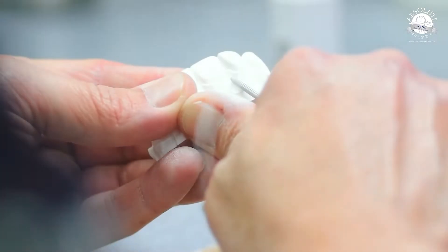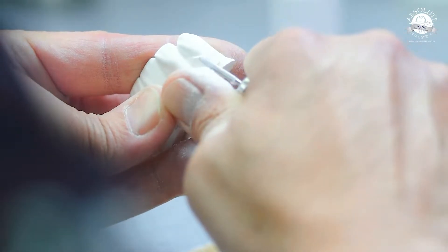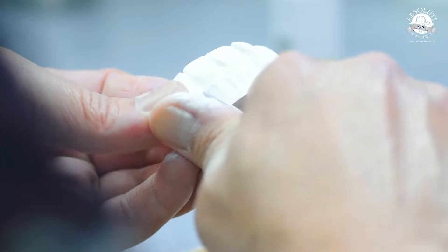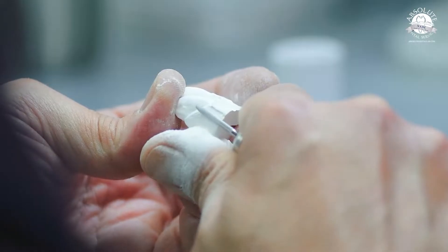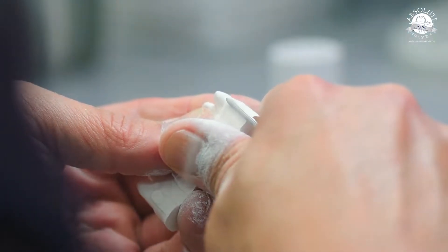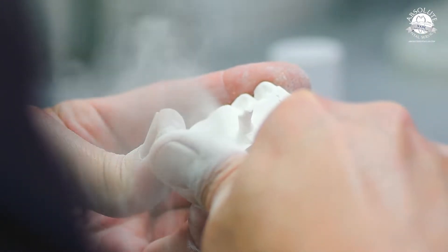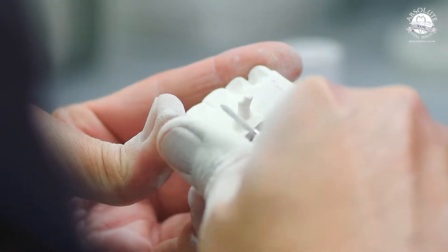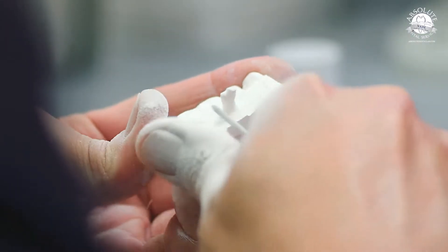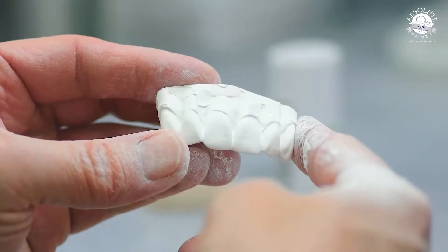That's kind of the goal. First things first, I'm going to remove the sprues. You can do it very simply by just using the large taper carbide — I use the taper more than the round end, I just tend to prefer it. I'm going to go through and do a quick reduction of the sprues. Once that's done, we'll dust it off and be able to start our green stage finishing.